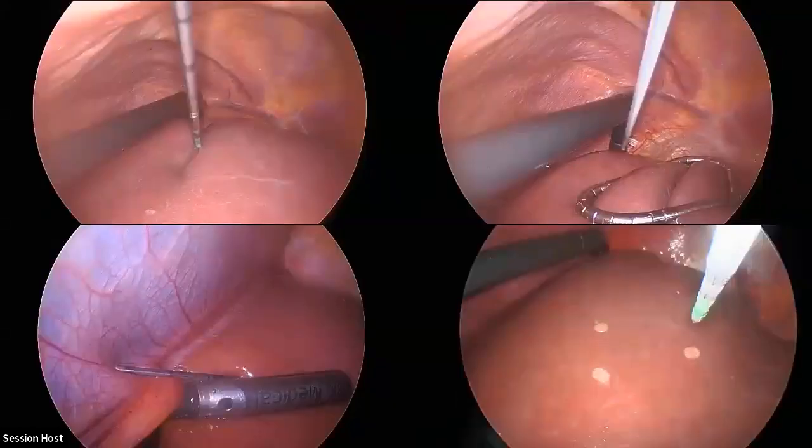So just some setup things. You're going to get more details about this later. But again, with that setup, this is just showing the lateral segment. It's easy to get an ultrasound over there with all the same setup.